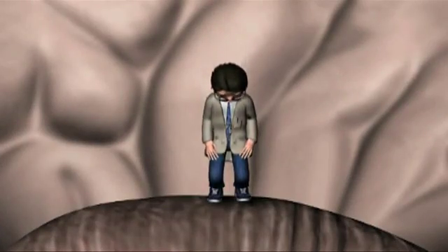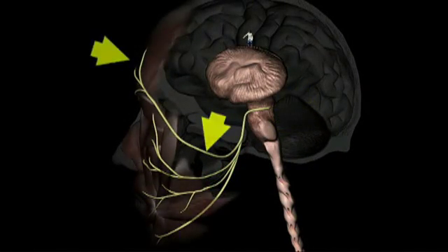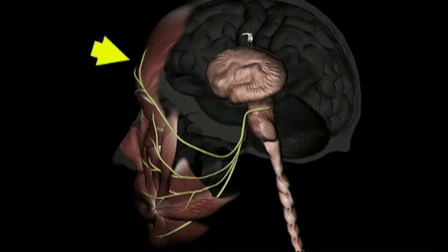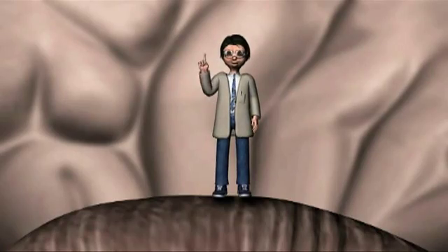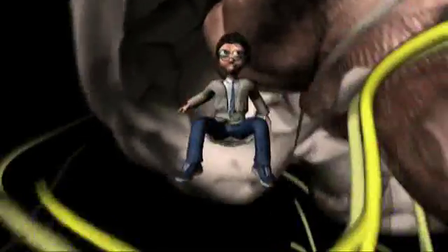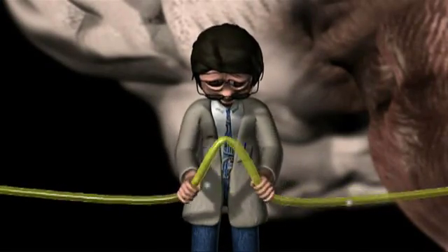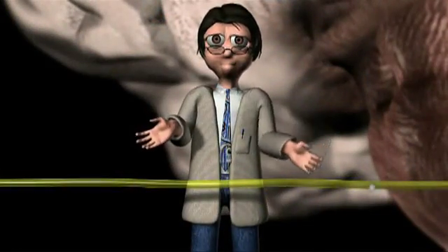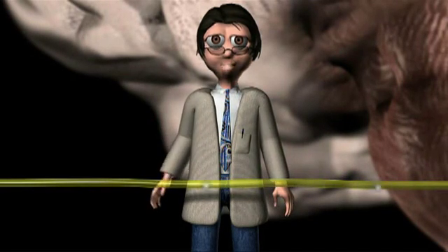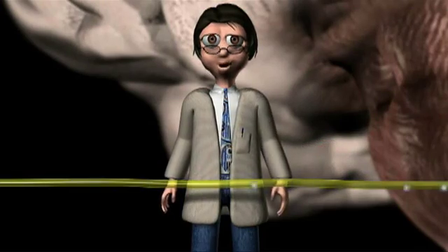Right underneath me is the brainstem. The seventh cranial nerve starts here and eventually goes over there to the facial muscles. We all know the facial muscles react to painful stimuli. Let me show you something. Watch what happens when I squeeze this nerve. Oops, sorry. But did you see that response? And did you know these responses can be recorded even with moderate levels of neuromuscular blockade?